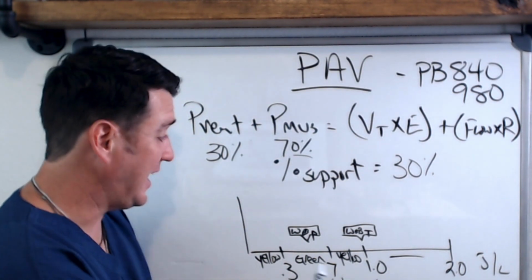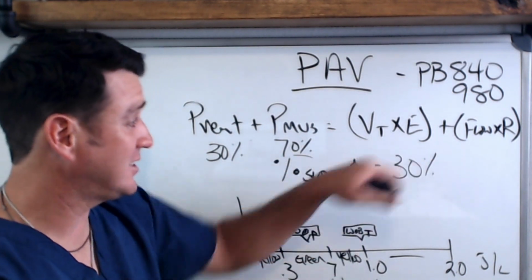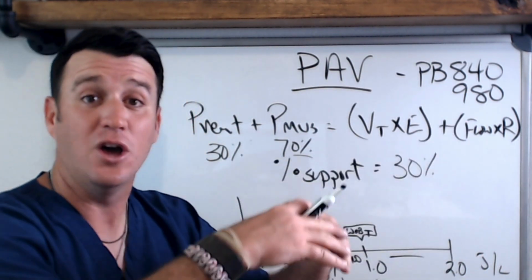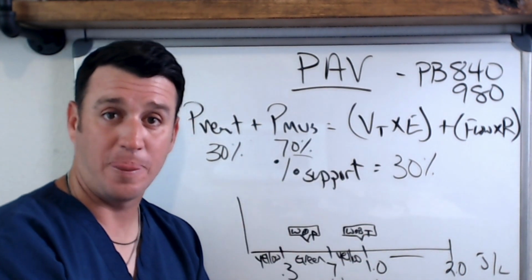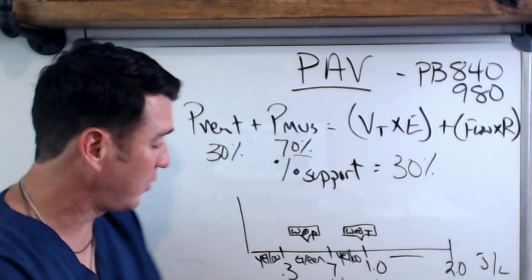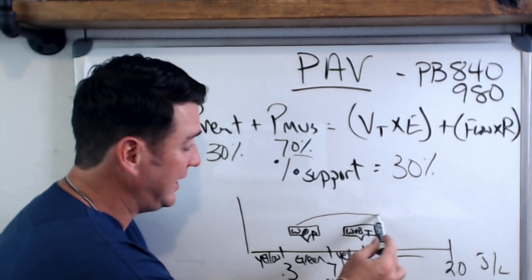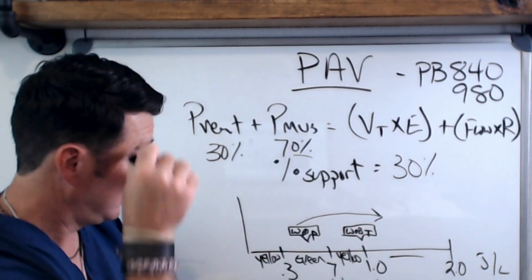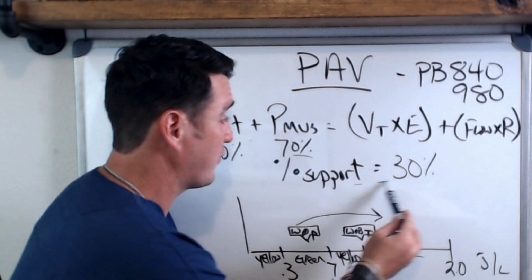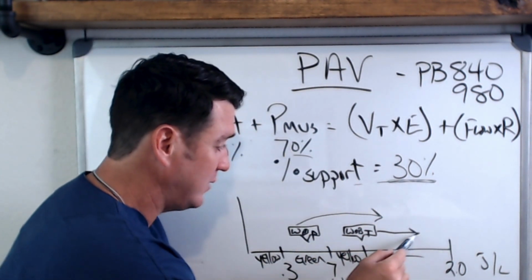Now, let's say that, and this is constantly moving. So as elastance changes or resistance changes or tidal volume or flow changes, then work of breathing changes. If the patient starts experiencing an increased work of breathing, this tab right here will increase because it's in joules per liter. Now, if you've told the vent to accommodate for 30%, then the total workload is also going to increase.